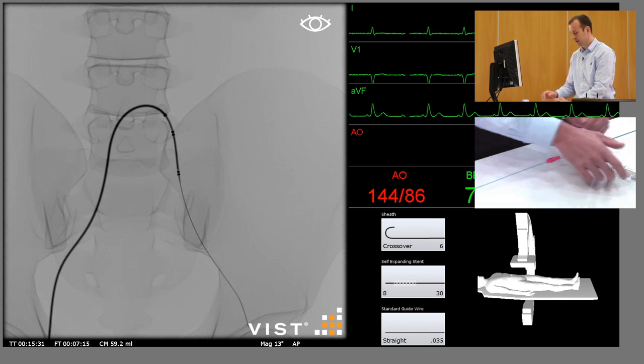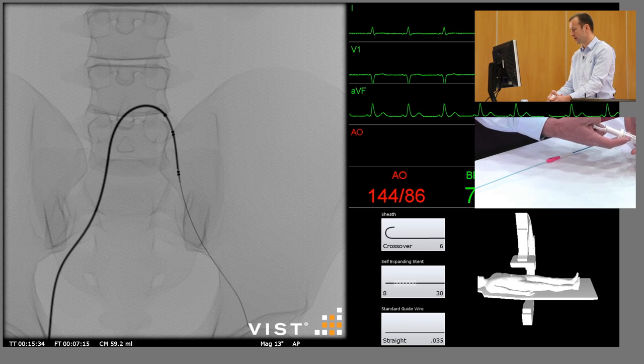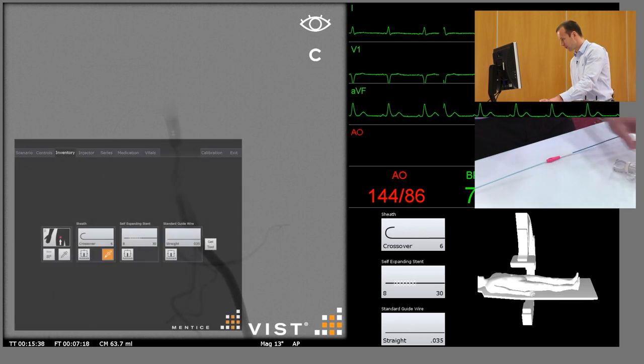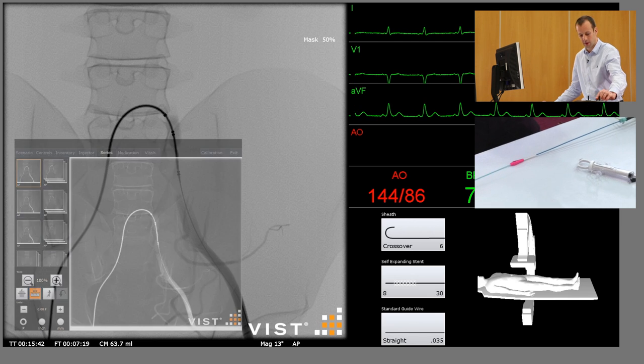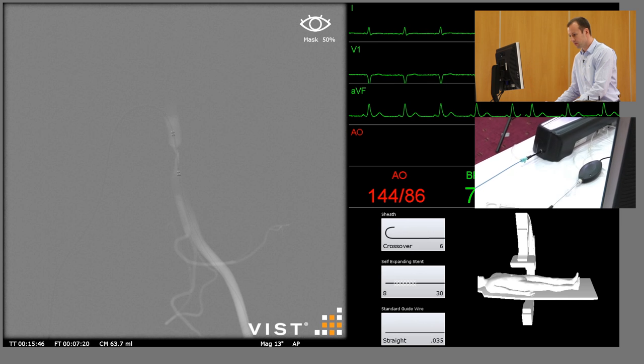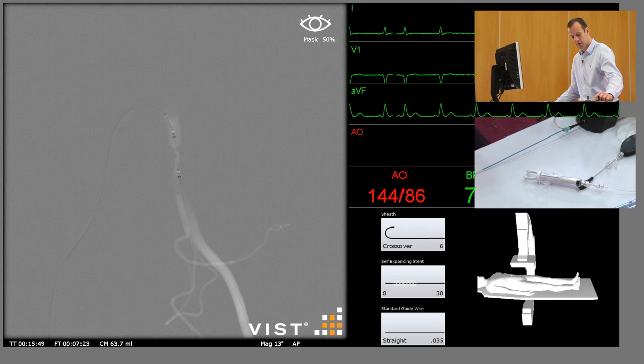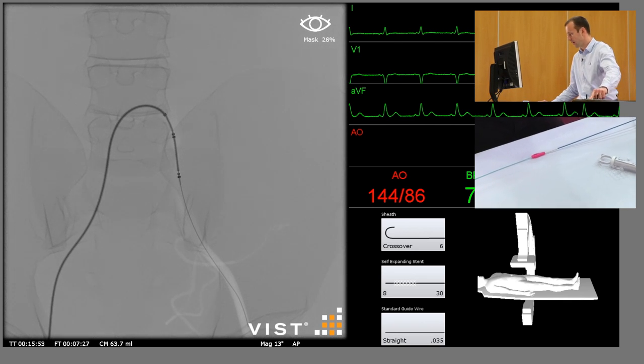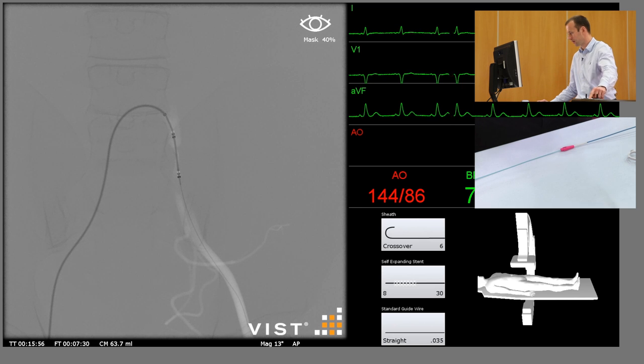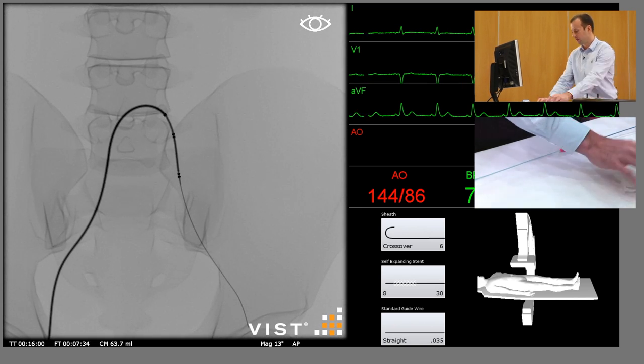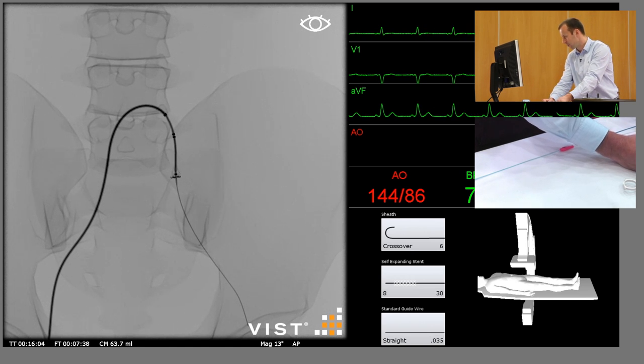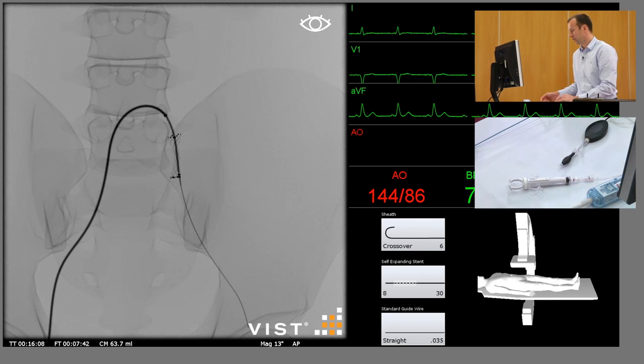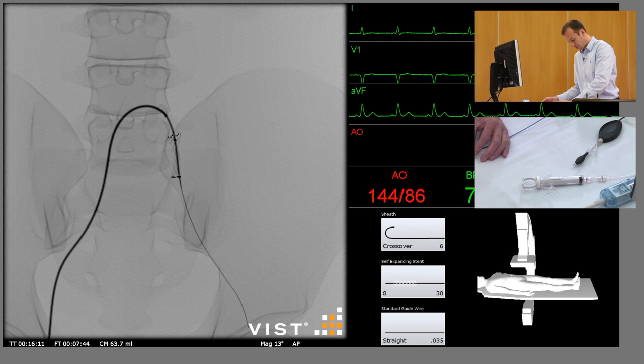To be as accurate as possible we can do another little subtracted run here, and this will show us that the stent needs to be advanced very slightly. We can fade the image in and out to demonstrate the correct positioning, but then fade all the way out to deploy the stent.